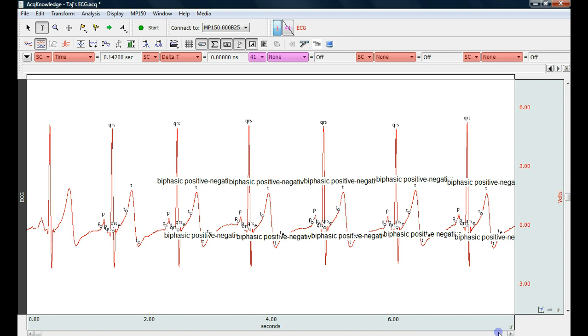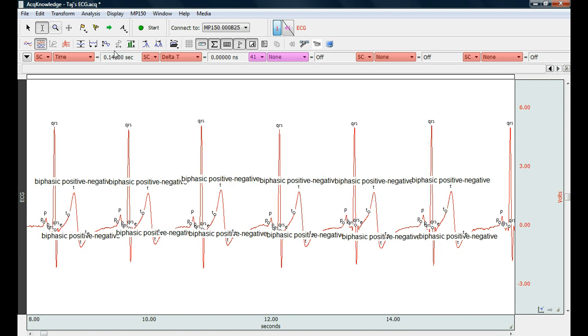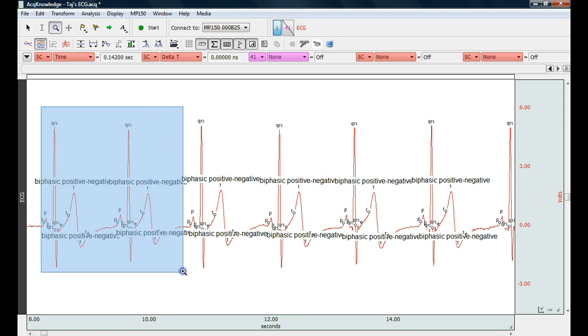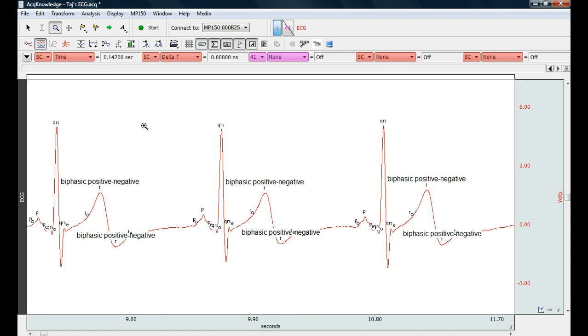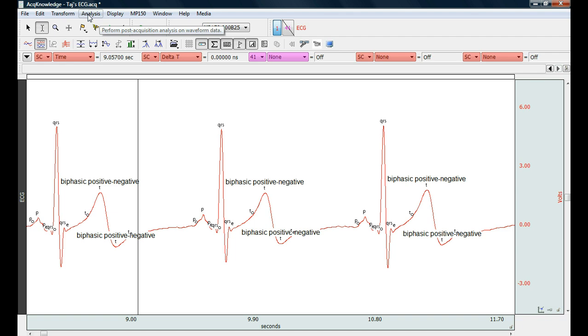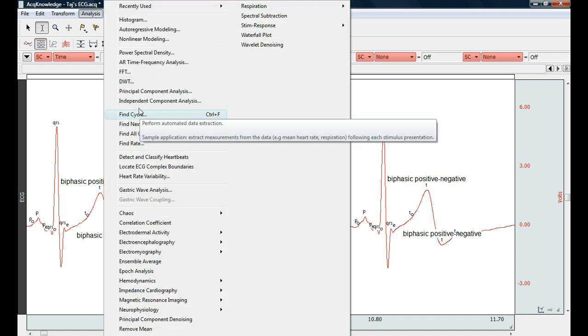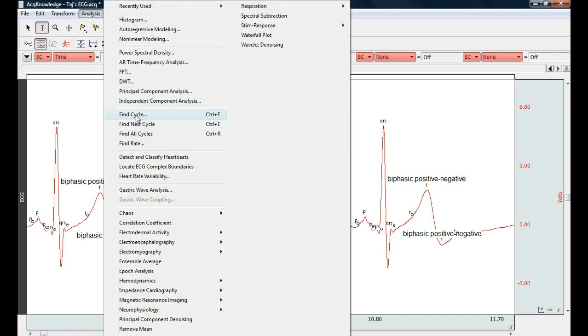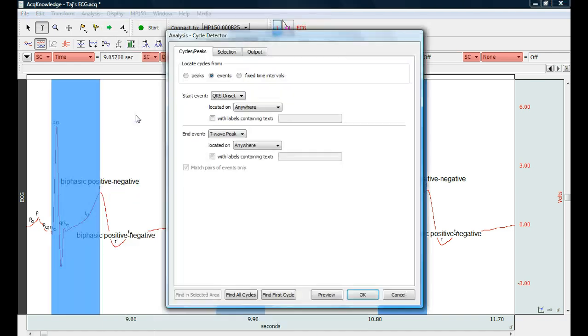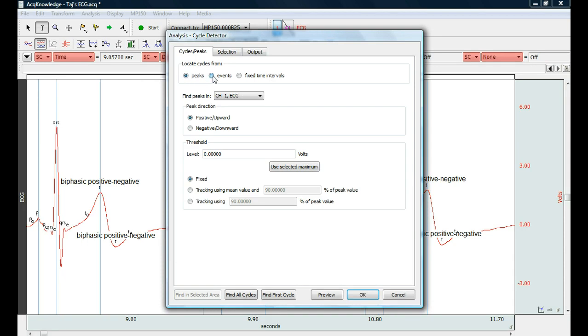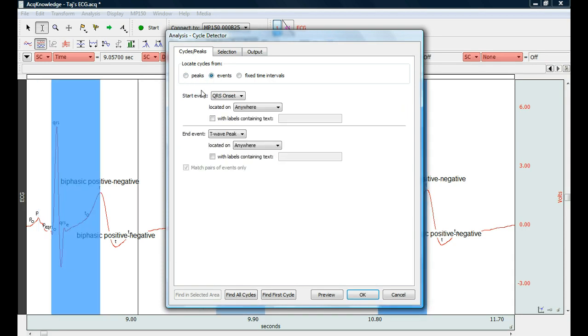So let's scroll over here just a little bit. Let's look at just a couple cycles. And the next step is back to the analysis menu and go to find cycle. And instead of peaks we're going to look at events because these are events right on the data.